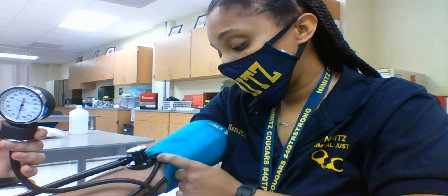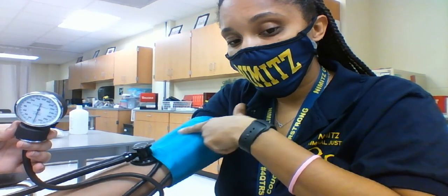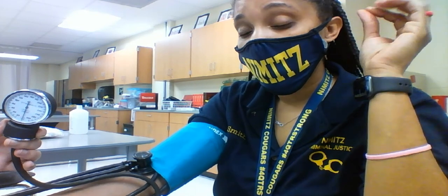Make sure that the arrow is down towards the artery. You're going to put your stethoscope on top, underneath the blood pressure cuff. You're listening for the first sound, which is the systolic. Then the very last sound you hear is the diastolic. And when you get those two numbers, the top number is going to be the first one you heard. The bottom is going to be the last that you heard.